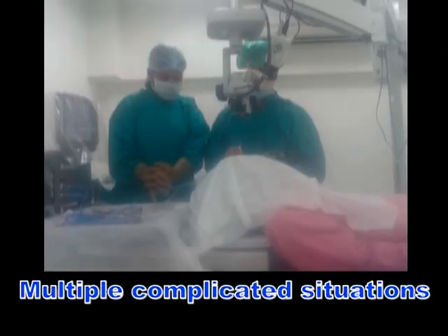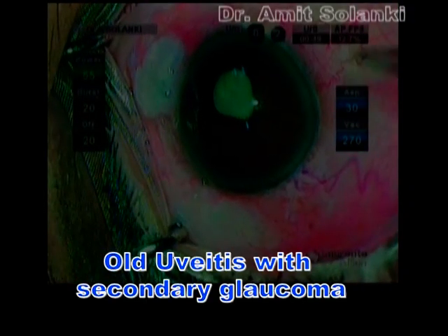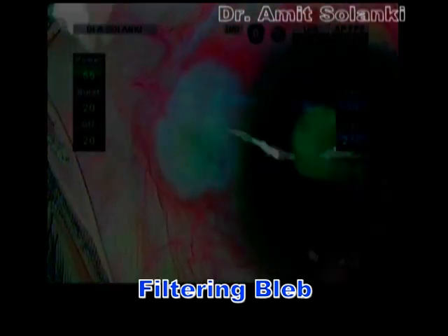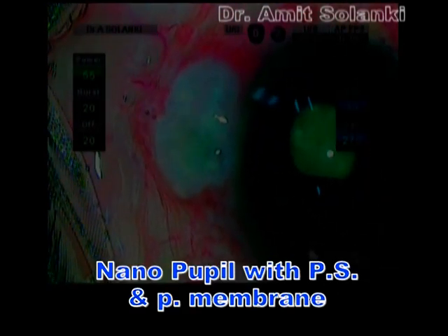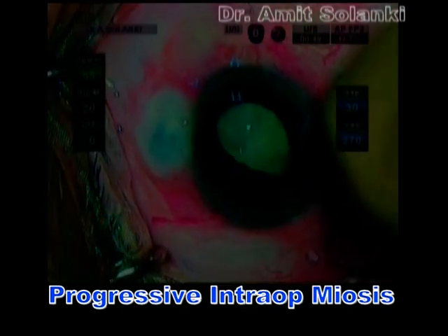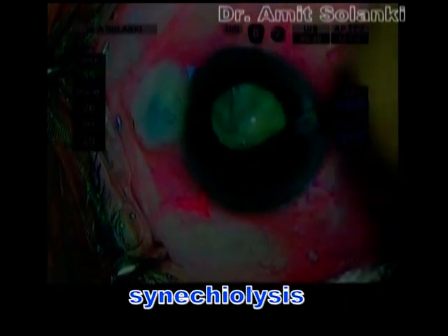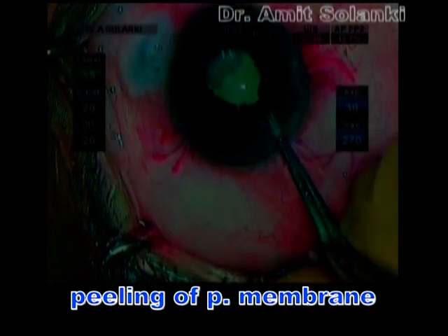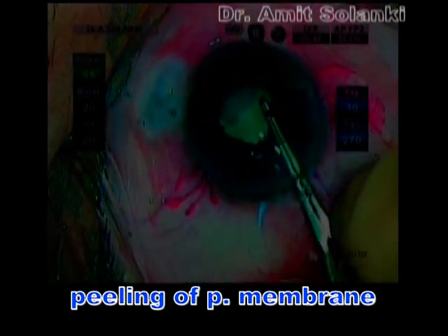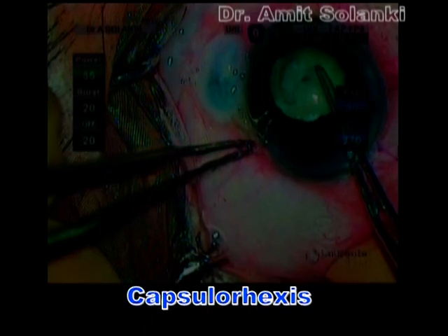In this next case, multiple complicated situations were present. The patient had kyphosis, so the entire surgery had to be performed in an abnormal posture. This was a case of old uveitis with secondary glaucoma. There was a filtering bleb, nanopupil with posterior synechia and pupillary membrane, and a complicated white cataract. First, synechia lysis was performed using a spatula. Then the pupillary membrane was peeled off, and after that, with viscousmydriasis, adequate pupillary dilatation was achieved.